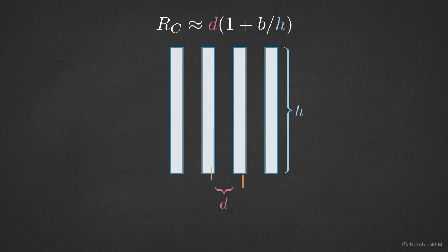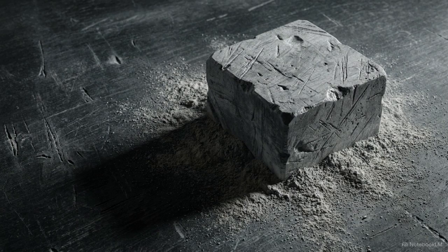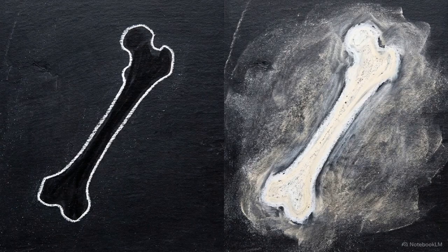But as holes lengthen and narrow, the vast majority of photons strike the lead and are absorbed. The sharp resolution starves the detector. The collimator enforces an inescapable physical compromise. You can have sharp spatial resolution, or you can have low noise. The lead prevents you from having both.